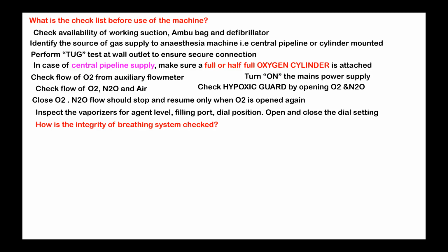So you require 2 bags to check. Yes, sir. One bag attached to the limb where you ventilate, the other you want to attach to the patient end and then check. Is it always required? Do you always have 2 bags in your OT for every machine? Yes, sir. I have 2 bags. So that is how you have been taught. Supposing you don't have a second bag, what will you do?